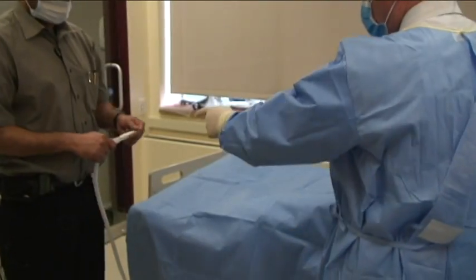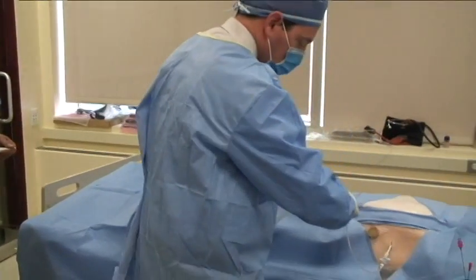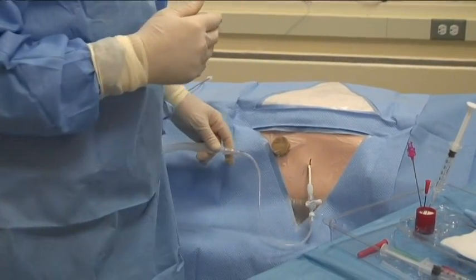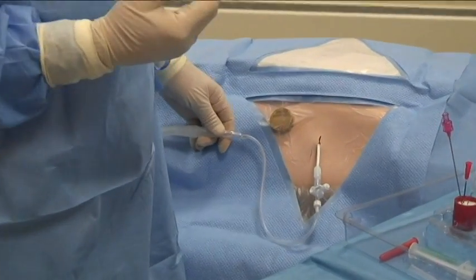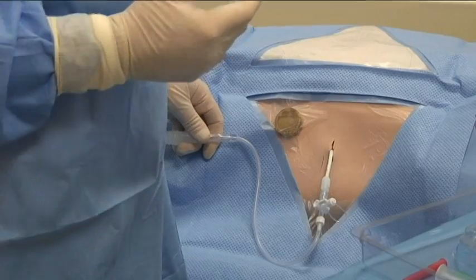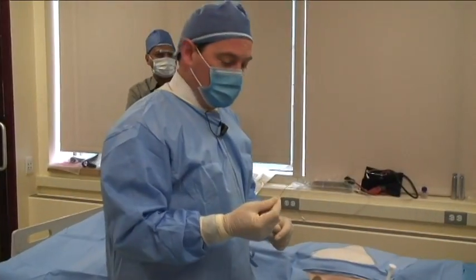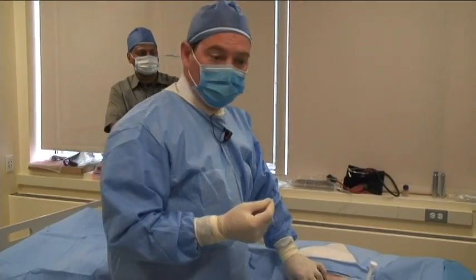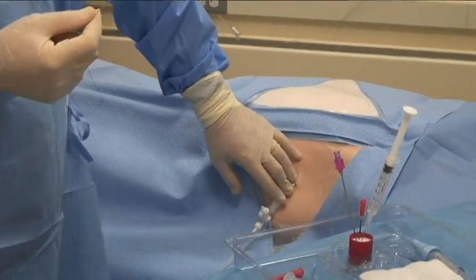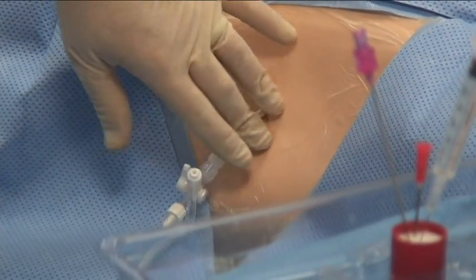At this point, Dr. Gopal will allow me to take this sterile end, and I can connect it to my chest tube. And now you're free to put the pleurovac onto suction if you'd like, or to leave it to water seal to gravity. These are decisions that can be made clinically based on the individual case. So again, at this point, what I would like to do now is to suture it in, secure it in place so that it doesn't move or fall out, and then apply an appropriate sterile dressing over the wound.